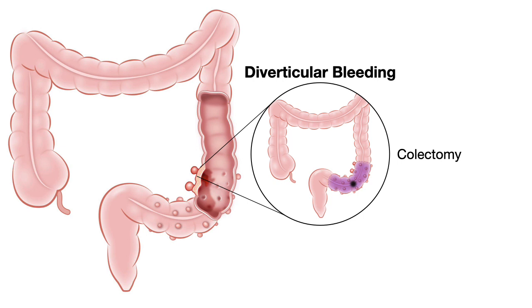If you don't have the source defined and the surgeon does a blind resection, the outcomes are not as good because those patients are likely to rebleed at a much higher rate. So, in this case, we have identified the source, we have put a tattoo, and send them for resection and anastomosis.